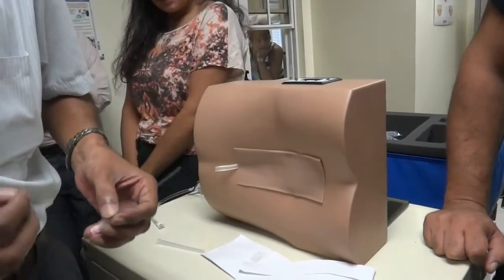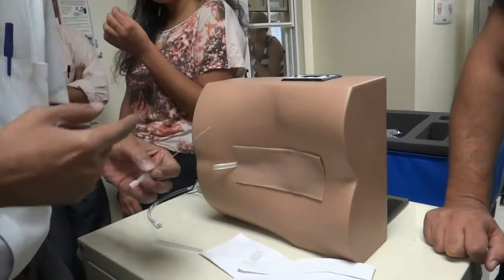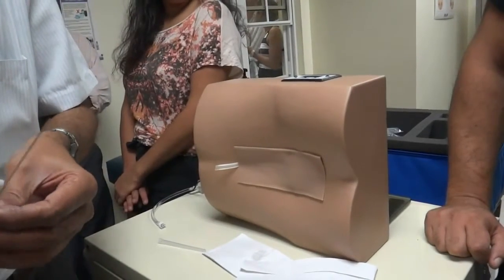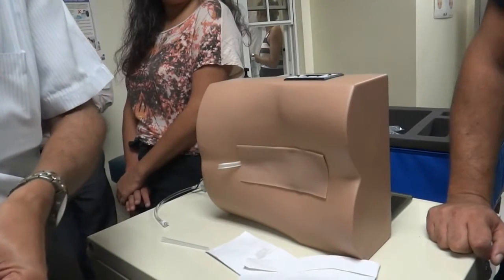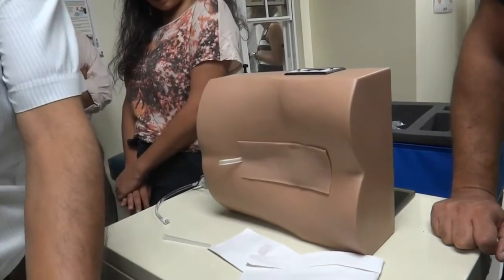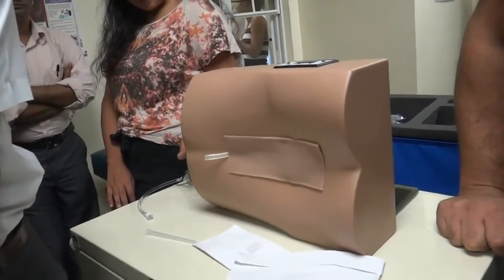So it looks simple. When you do it, you'll find there'll be problems. You will hit the bone. Does it matter which way the bevel is when you put it in? In other words, does the bevel have to be pointed up or down? No. Here, because we are going absolutely horizontally, it doesn't matter. It's only when you're doing a venipuncture that the bevel has to be up.